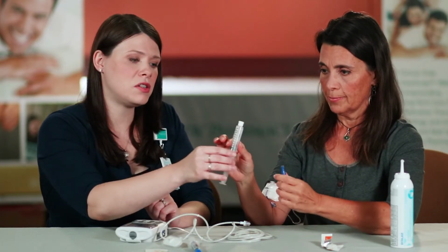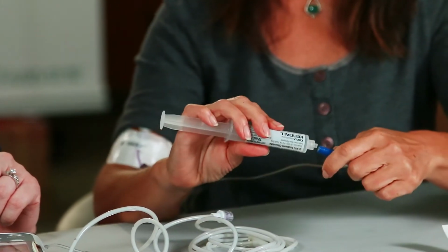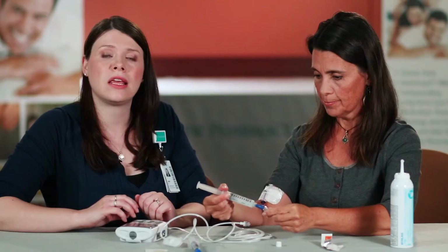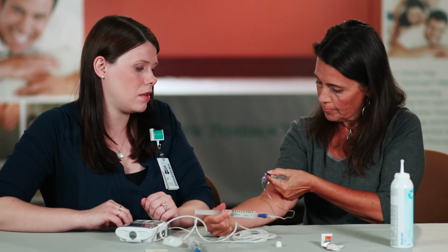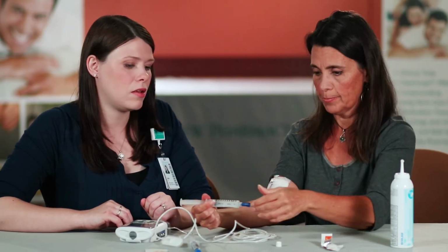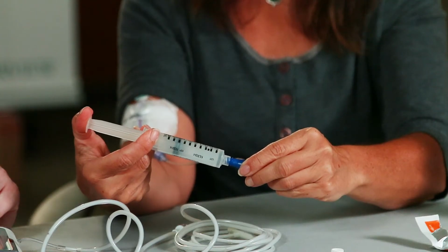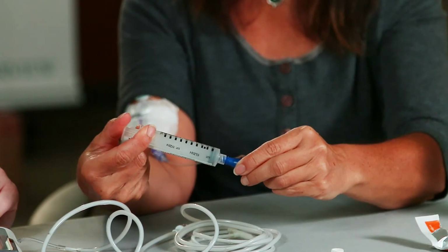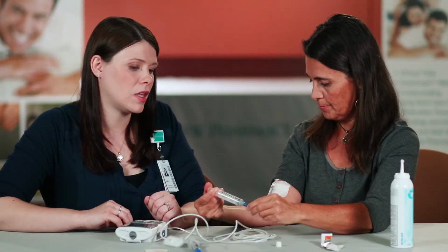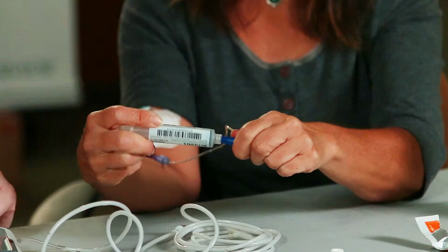Attach a saline syringe. If your line has a clamp, undo the clamp. Flush using the pulse method. Push stop, push stop. Reclamp your line and disconnect.